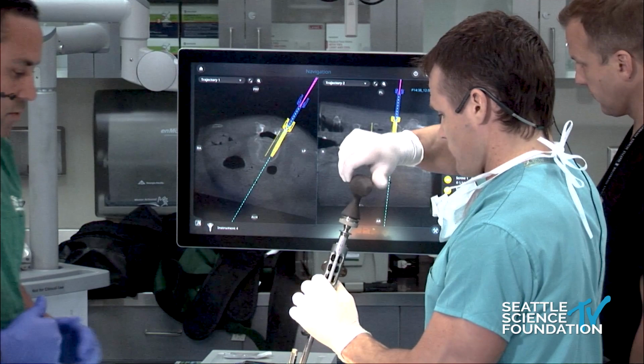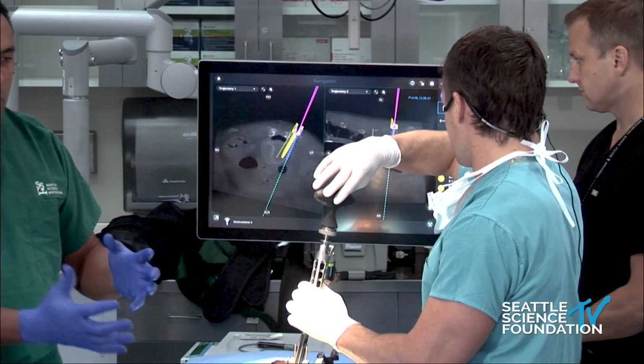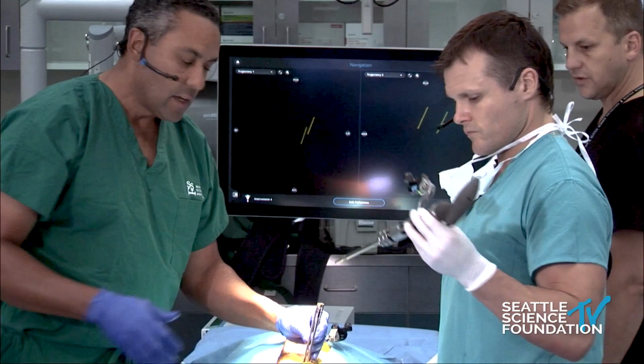That can't have been longer than 1 minute. Yeah. No radiation, no K-wire. You know, minimal steps. You can actually do this in one fewer step. And we did. We only had two. We only had one working drill. I actually prefer to do all of this with a drill, so I'll do all of it. You're good. And then there is an option of doing this in a single step. Yeah. So, any questions?